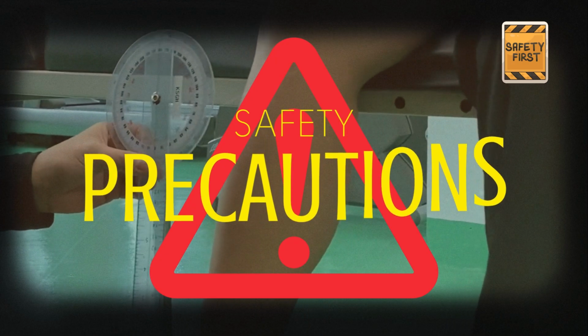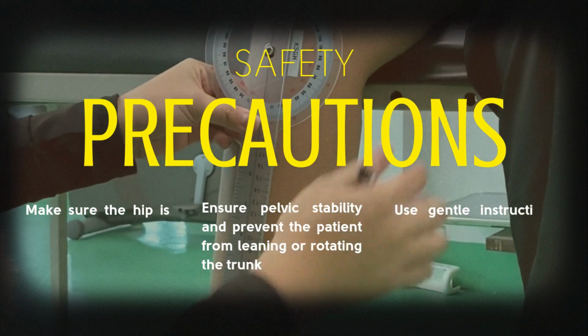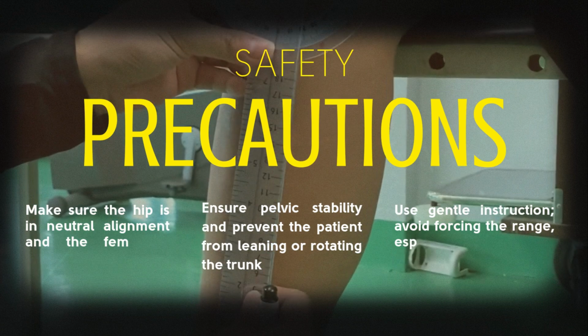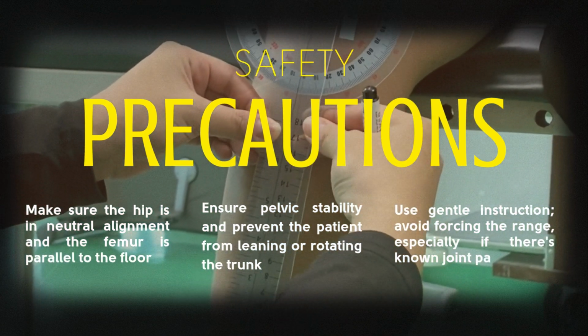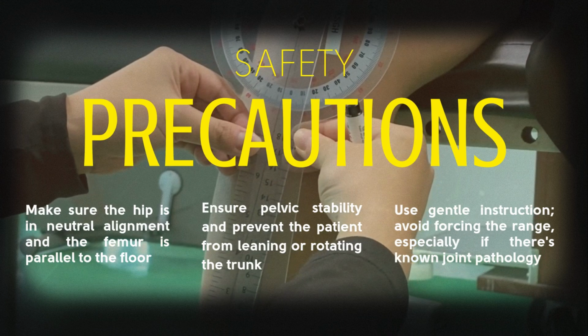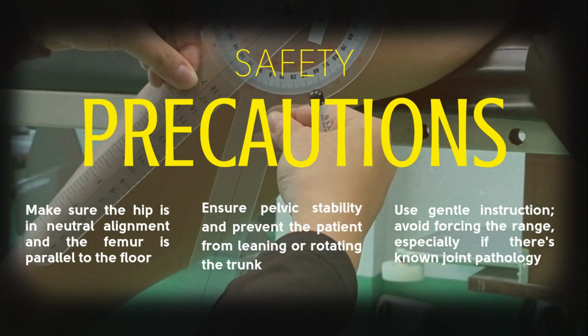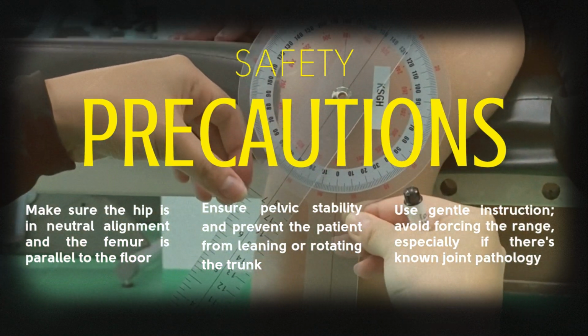For safety precautions, make sure the hip is in neutral alignment and the femur is parallel to the floor. Ensure pelvic stability and prevent the patient from leaning or rotating the trunk. Use gentle instruction. Avoid forcing the range, especially if there is known joint pathology.